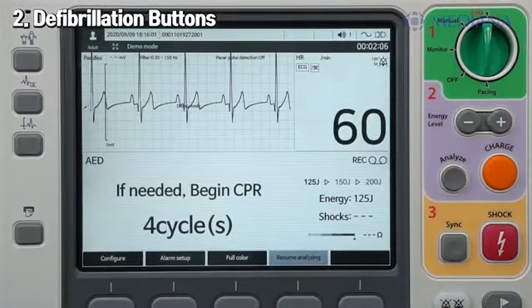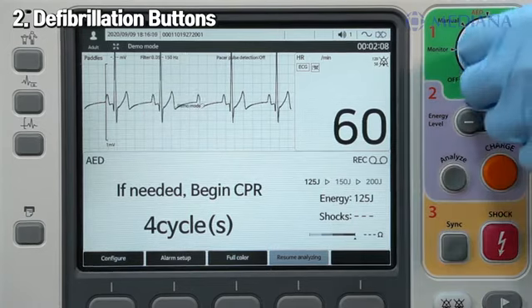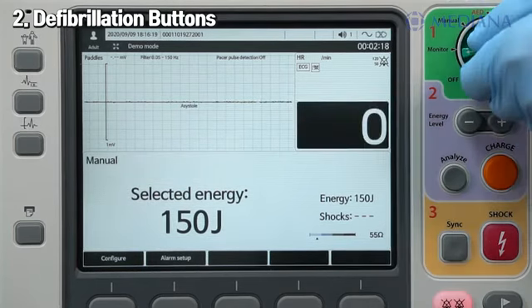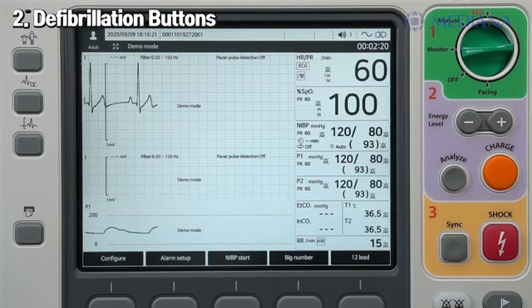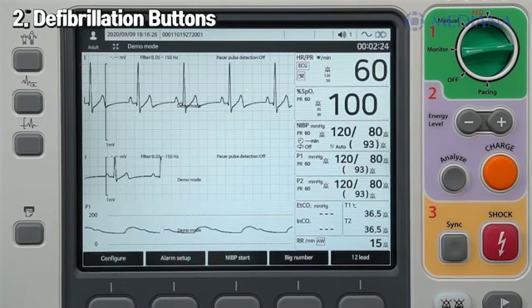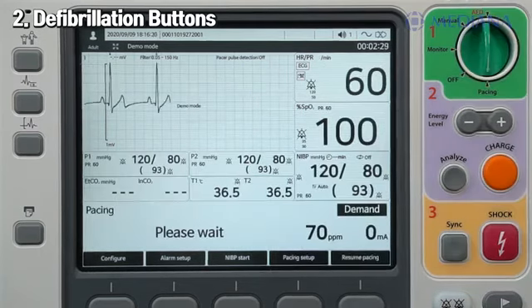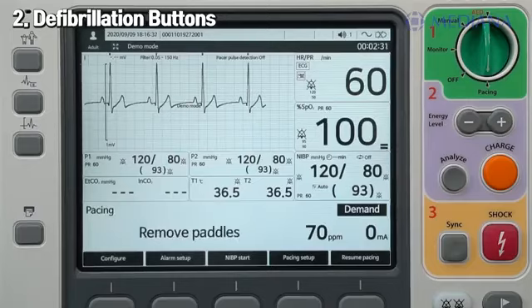The user may change the color filter setting. By default, the screen is set to color, but it can also be set to black and white mode. When the device is used outdoors, visibility may be reduced due to strong external light. Therefore, if you change the display setting to grayscale mode, you can switch the screen to black and white, which makes the visibility better than color and improves user convenience.